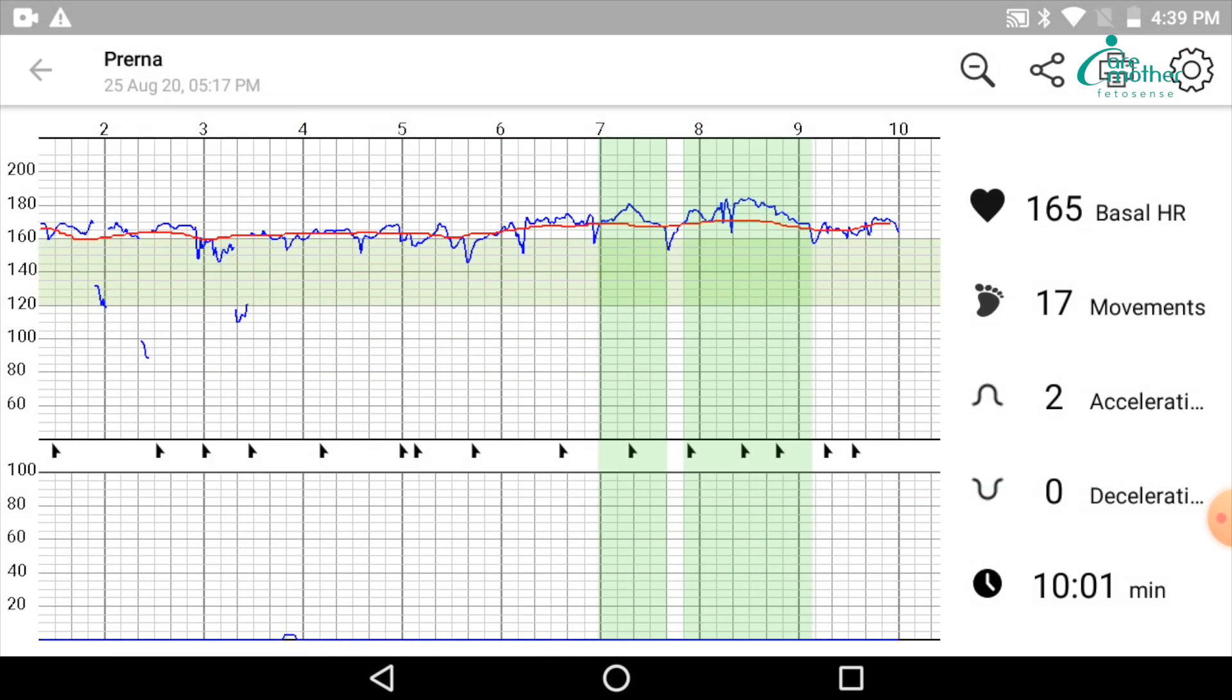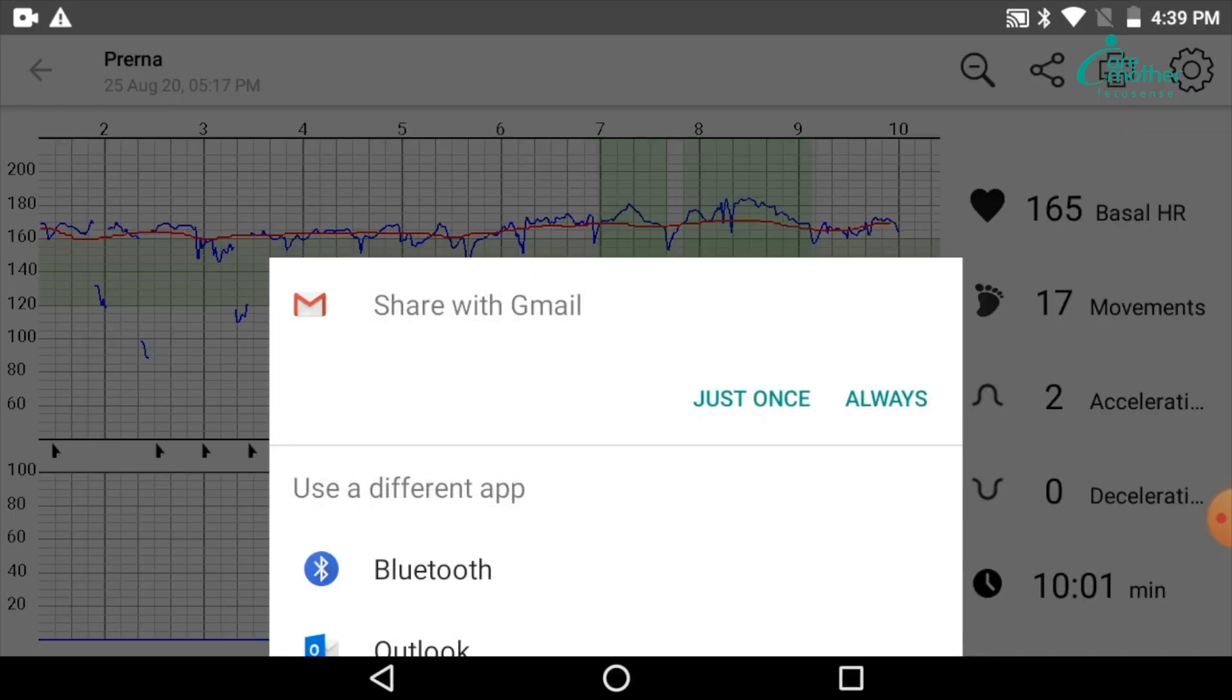If I click on the test, it appears like this. At this point, you can share the data or print the data. How to share the data? You have a share tab over here. You can click on this.